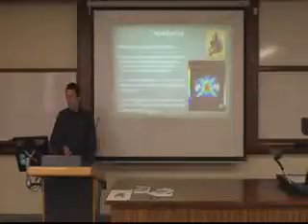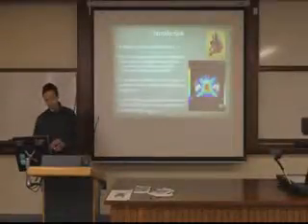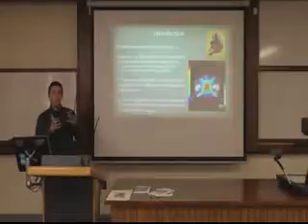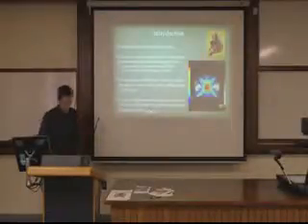The 3D dose distributions that they've created in these modern treatments have steep dose gradients outside, so when you have intra-treatment movement, so motion while the treatment's going on, then that tumour can get outside that therapeutic zone, and that can cause errors in the prescribed dose.